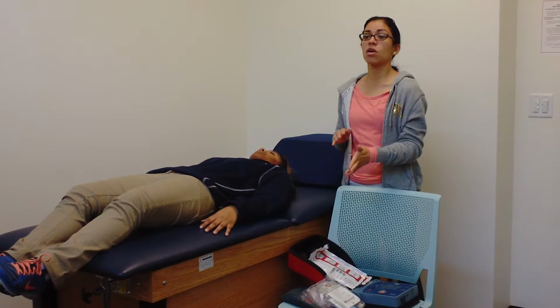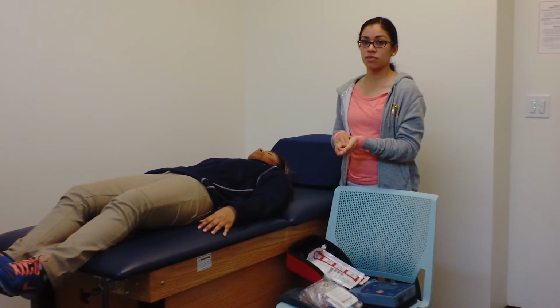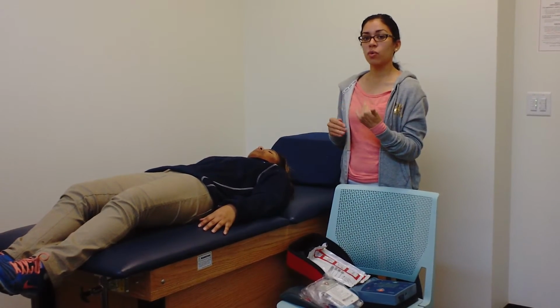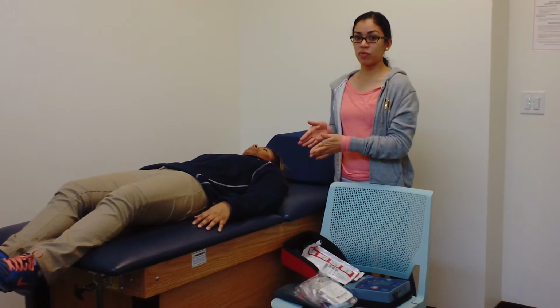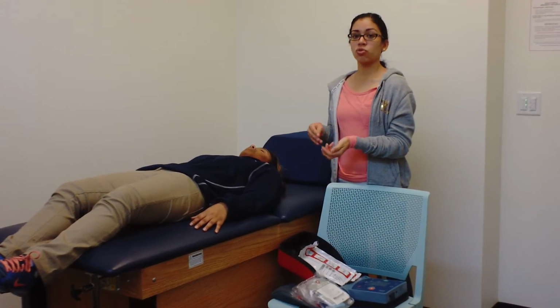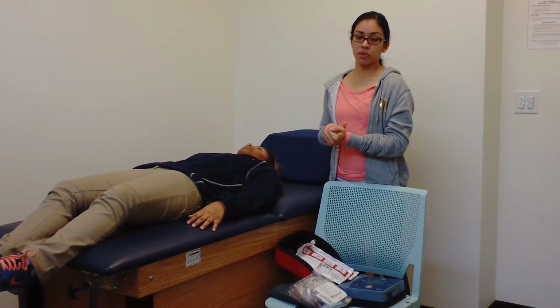Once the paramedics or emergency medical services arrive, I'm going to let them know what has happened and what I have performed so that they can take control and transport them to a hospital if needed.